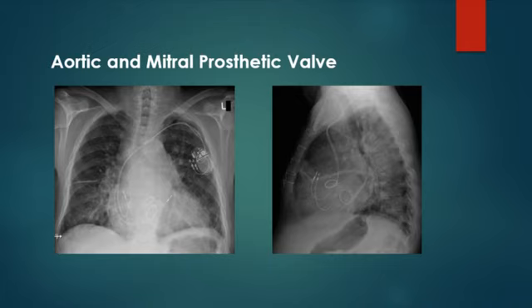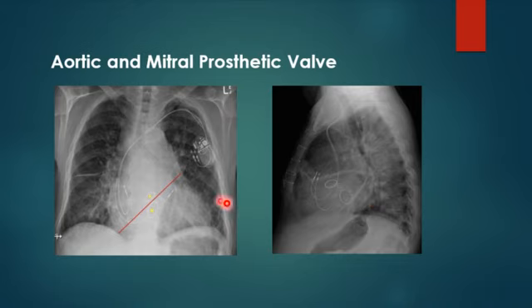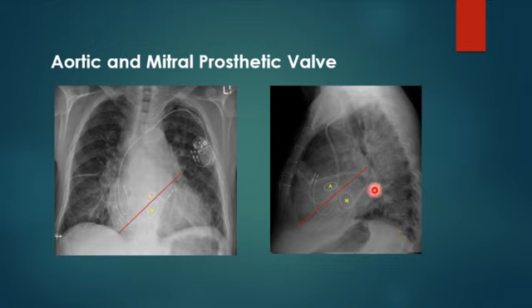For example, this 35-year-old male with a history of rheumatic fever — one of the most common causes of valve disease — has two prosthetic valves visible. Drawing a line from the left atrial appendage to the right cardiophrenic recess: the valve above directed toward the aorta is the aortic prosthetic valve, and the one below directed toward the apex is the mitral prosthetic valve. Confirmed on the lateral view by drawing a line from the carina toward the apex.